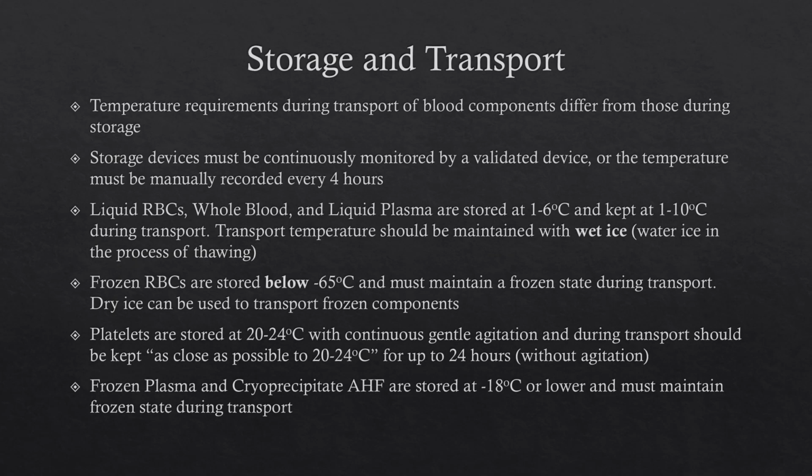Storage and transportation of blood components. One of the things to keep in mind is that the storage requirements are usually more strict than the transportation requirements for a blood component. Those are going to be different values. The technical manual has a great table that goes through each blood component and their requirements for both storage and transportation for each one.